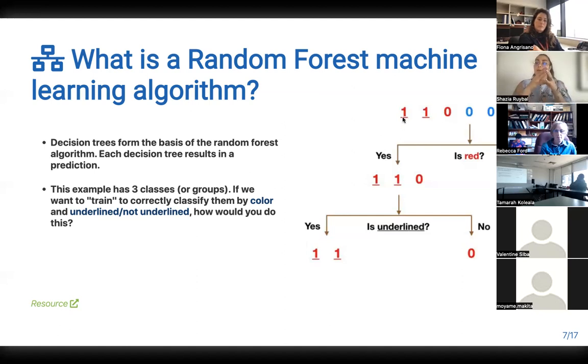So this is what the algorithm is going to be doing with our data. And it's going to have the information for all 11 antigens. And it will say, okay, is there a presence of antibodies to S1? Yes. Okay, then maybe it's SARS-CoV-2, but are there also antibodies to influenza? Yes. Then what does that look like? And that's how it's using the information from all of the antigens to come up with whether a sample is from a person who was recently exposed, so positive, or negative, not exposed. Any questions at this stage?